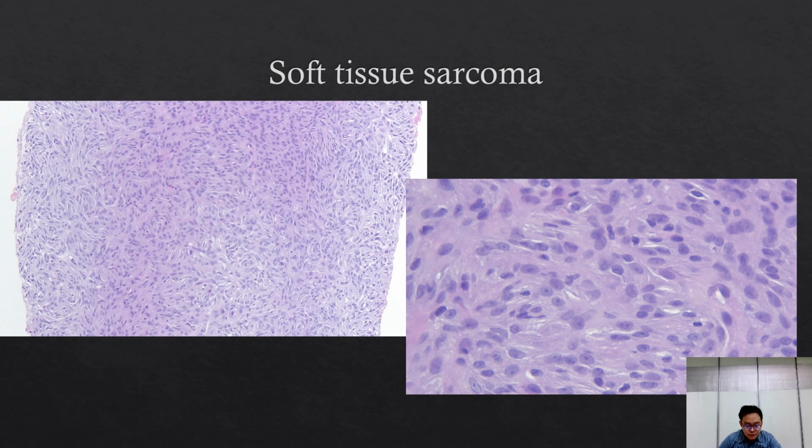And usually these cells are what we call spindle-shaped cells, so they form basically a flattened, elongated football almost. When we see this kind of orientation with them forming streams like that, with spindle-shaped cells, those are key things that tell us it is a sarcoma when we initially see that.